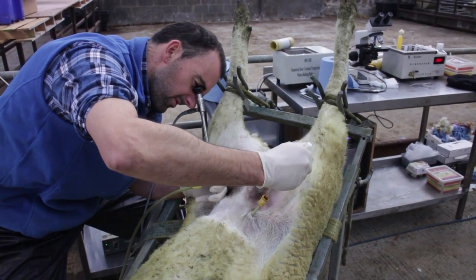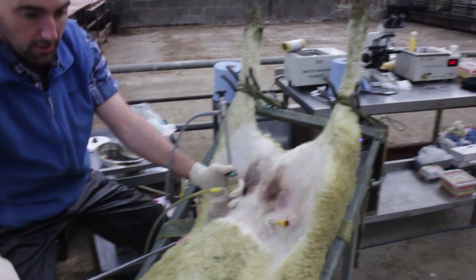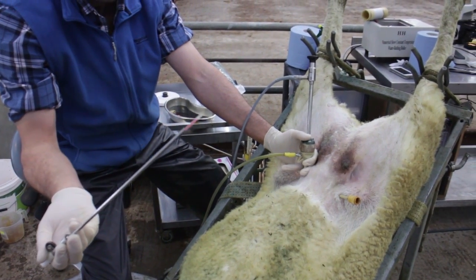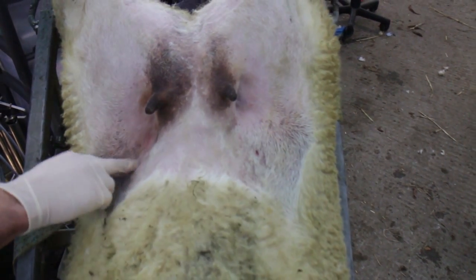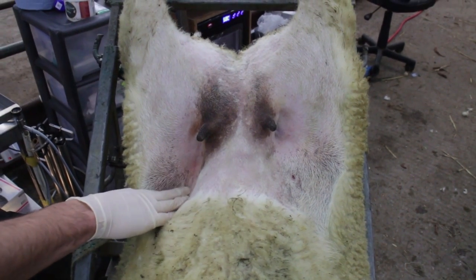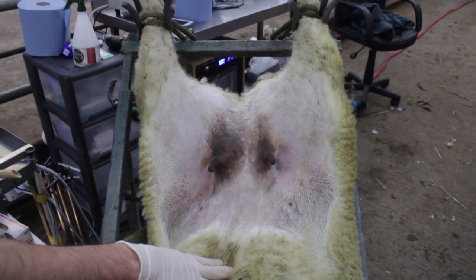As you can see, that's the tip of the needle — a short needle, about five millimetres. That's it. It's a very small area where it's gone through and that'll heal up by itself. There's no need for a stitch or anything — just a bit of blue spray and some LMS spray onto that, and she'll get a long-acting antibiotic as well.